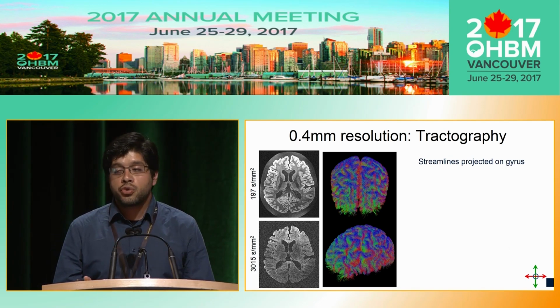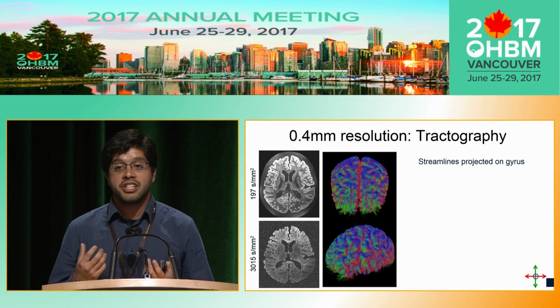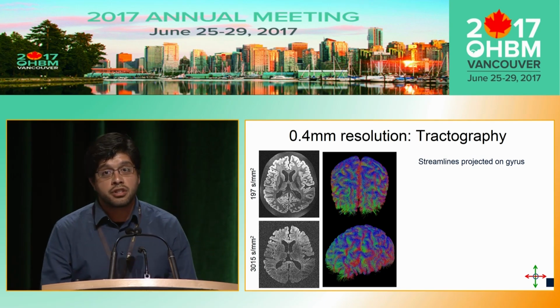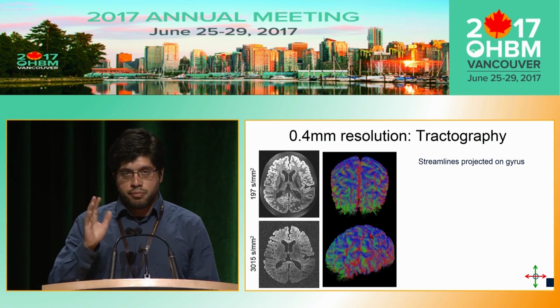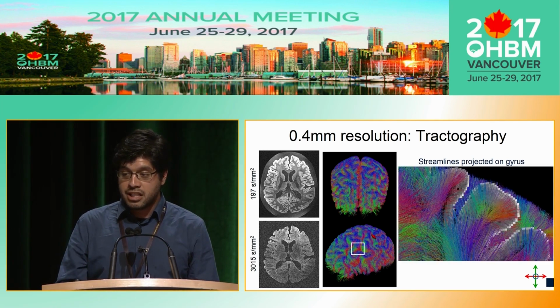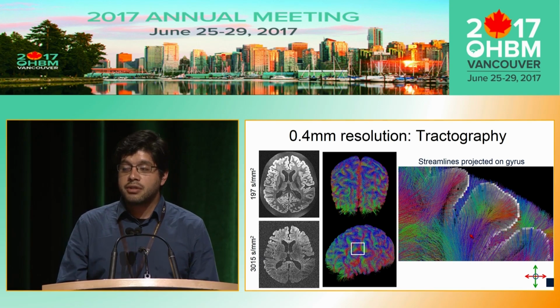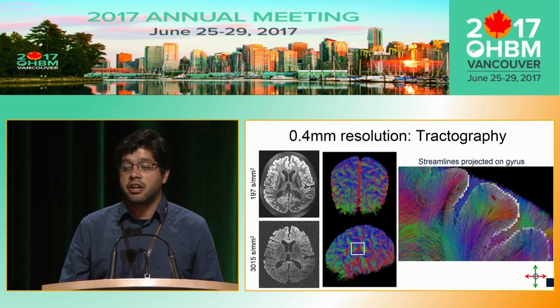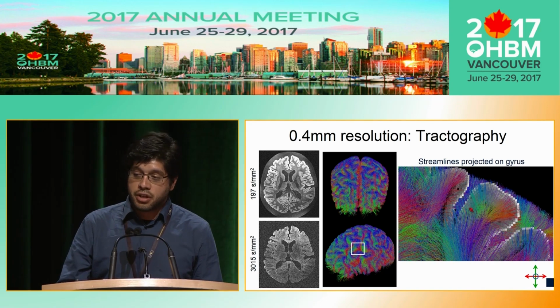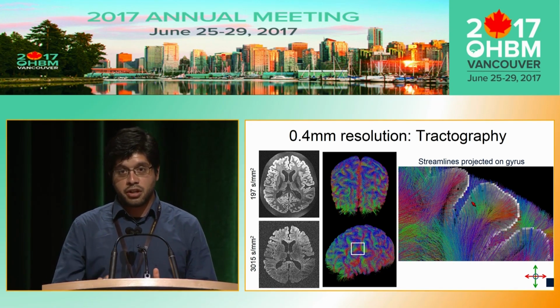This tractography shows you actually a very smooth distribution of the gyri and the sulci across the surface of the brain in two different perspectives. And especially if you take one of the gyri, you can see how the streamlines are crossing radially across the gyrus crown, and it started to touch in this part with the sulcus wall.